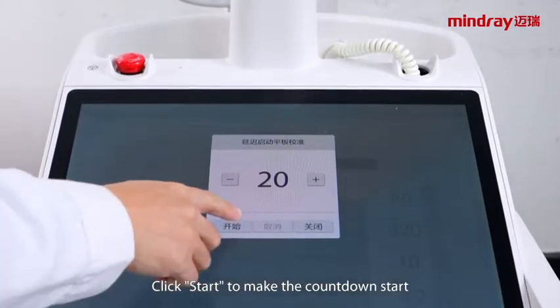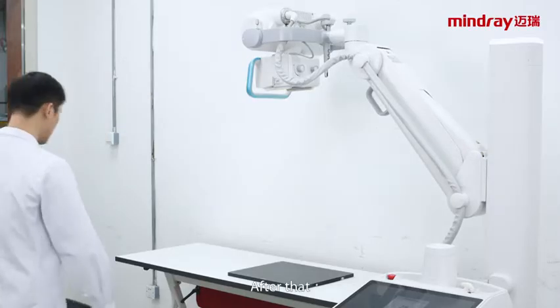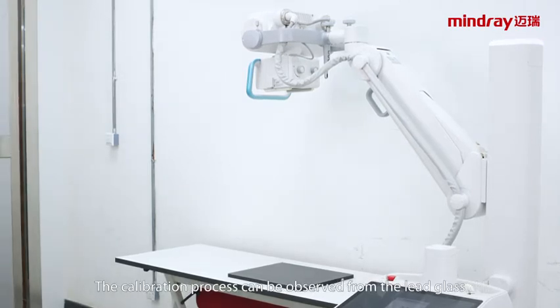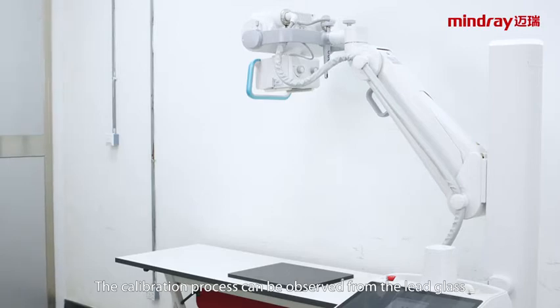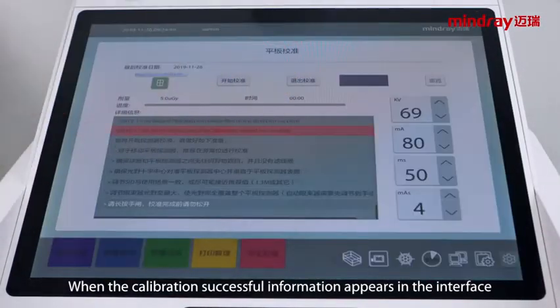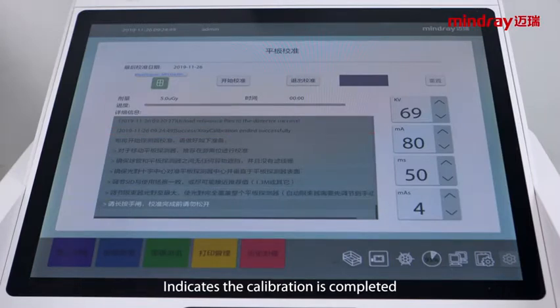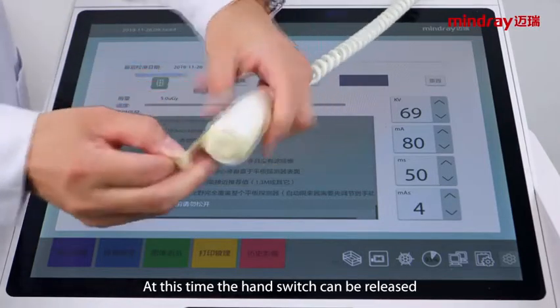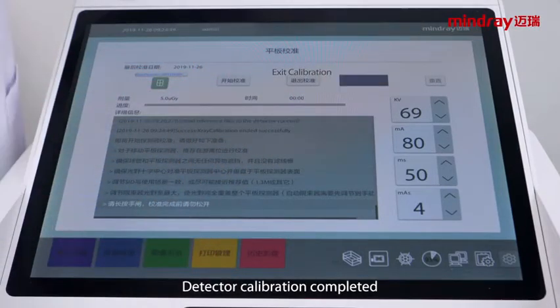Click start to begin the countdown. After that, please leave the shooting room and close the shooting door quickly. The calibration process can be observed from the lead glass window. When the calibration successful message appears in the interface, the calibration is complete. At this time, the hand switch can be released.